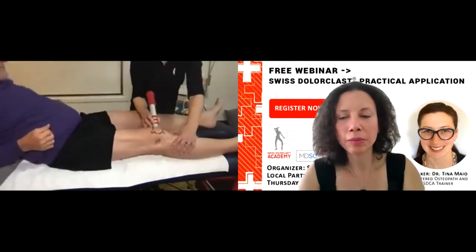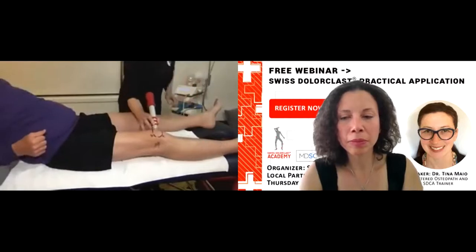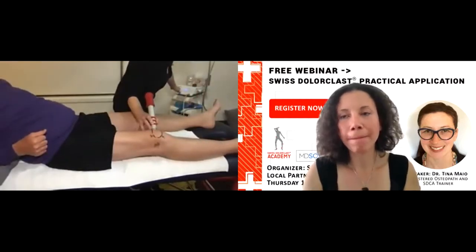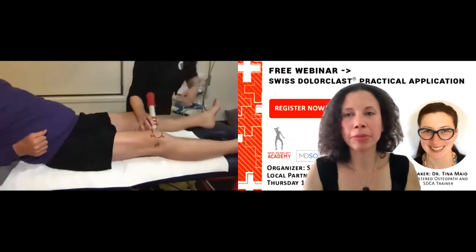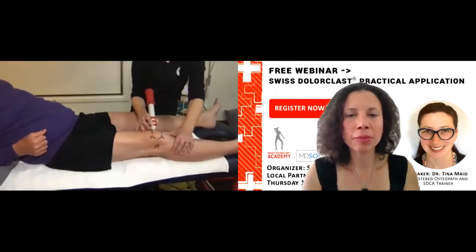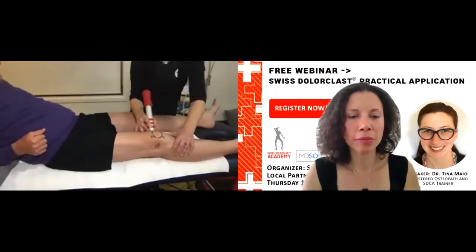How's that? That's less. Less pain? So out of 10? A 6? So I'm going to put it up a little bit. How's that? 7. 7? Okay. So it depends on your patient and what they can tolerate. So really important that you keep asking them how they're feeling.